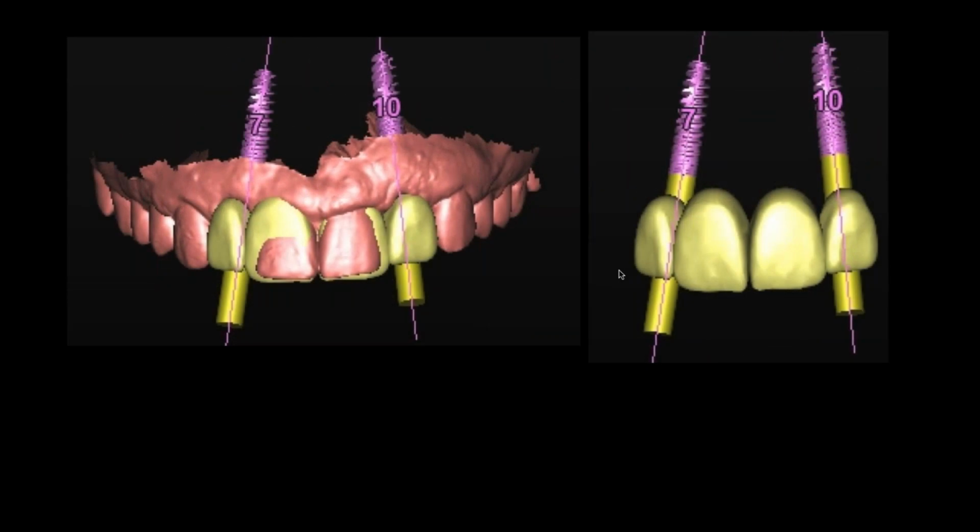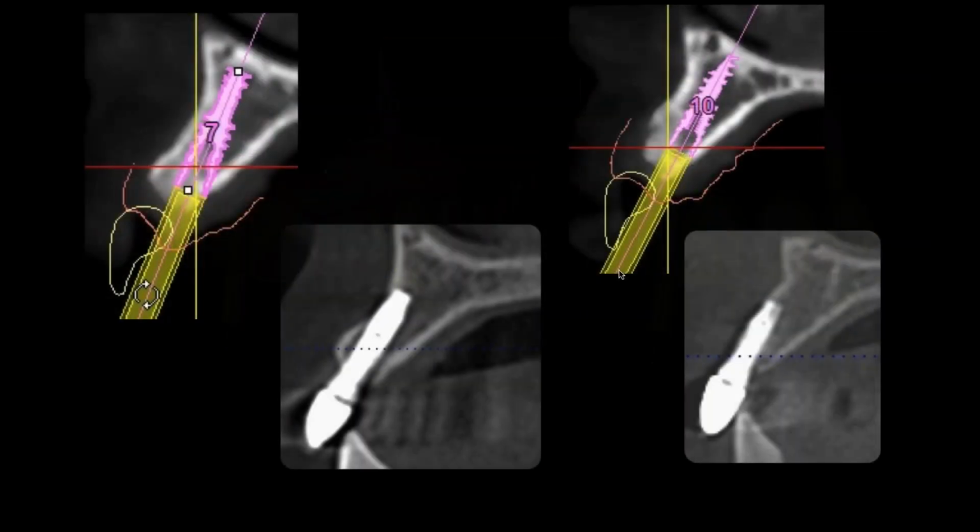And then, once you get that in position, you start saying, aha, this is why we need to treat her. So now what we need to do, we have very, very easily, we've taken her totally digitally into the plan, and we've played with the spacing, with the proportions of the teeth, and this is really simple to do. It's not hard to do. You just sit there and play. It's like a video game, and I have so much fun doing this, I don't even want to charge the patient for doing this. I'll charge them for some things, but not this. Anyway, so now we have it all set.